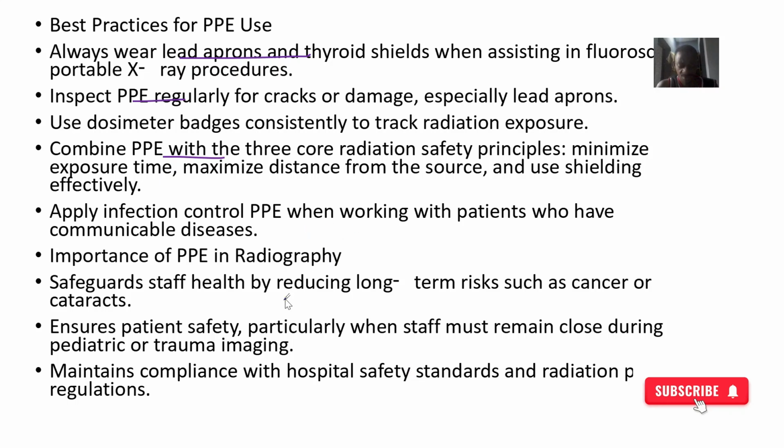The importance of PPEs in radiation is this: you safeguard staff health by reducing long-term risks like cancer, and ensure that the patient is safe, particularly where staff must remain close during pediatric or trauma imaging. Then it also helps maintain overall hospital safety standards.